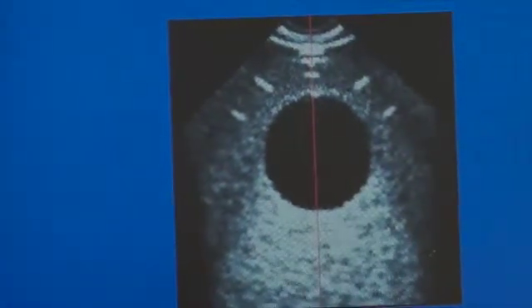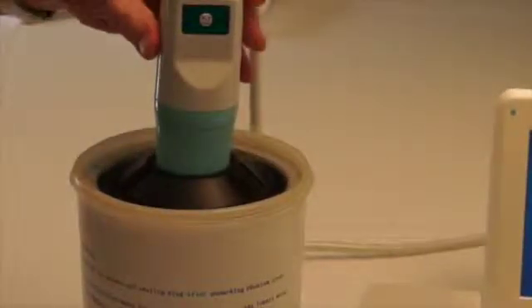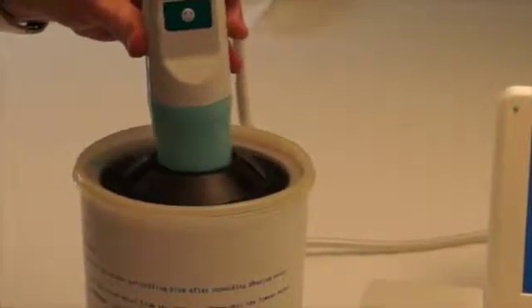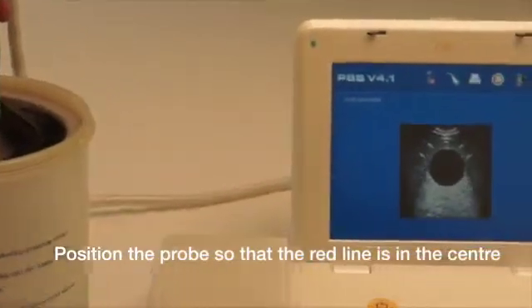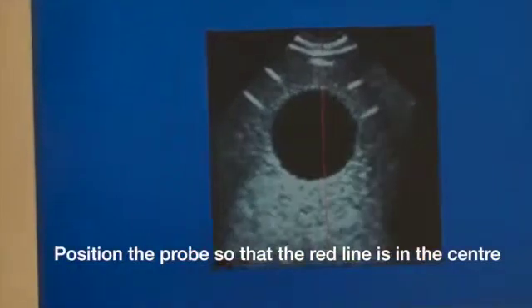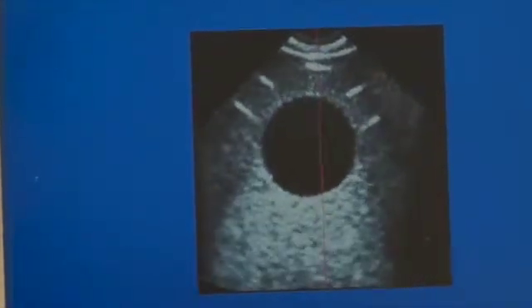Now, by adjusting the angle of the probe in the top of the Phantom Bladder, it alters the image displayed on the screen. You can see it changing from left to right. The objective is to set the red line into the middle of the black sphere.